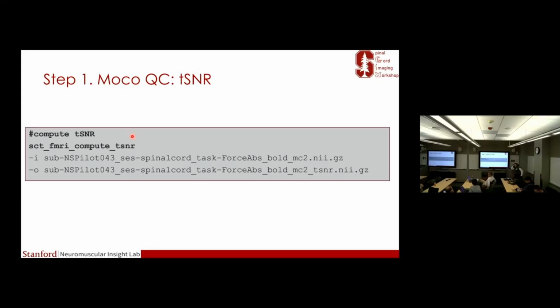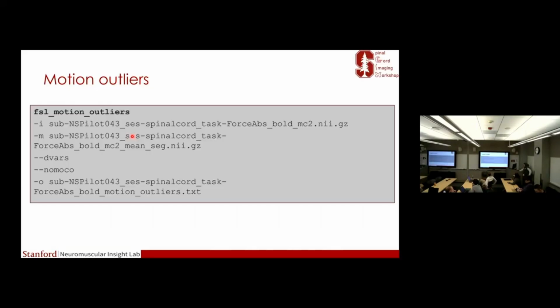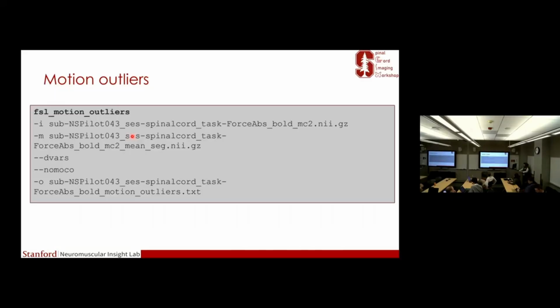But it's a good point, and if a reviewer asked us, we would do it. We do save the transforms for each volume, I think, so we could use those easily to do both. I think also being transparent is very important, exactly saying what TSNR we are reporting. And one good thing is that if the data is online and public, one can always check the data quality.